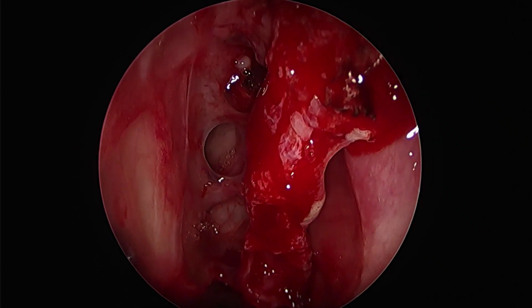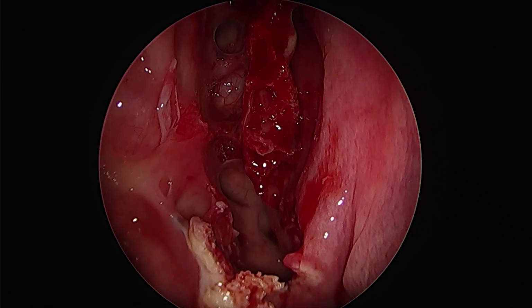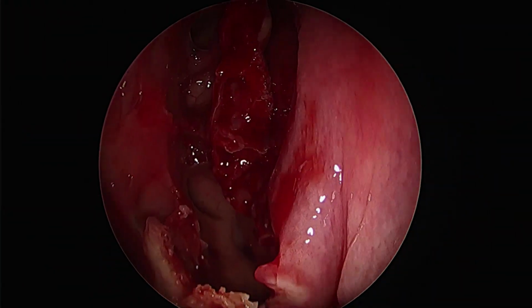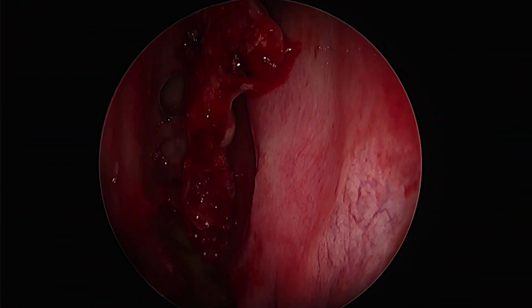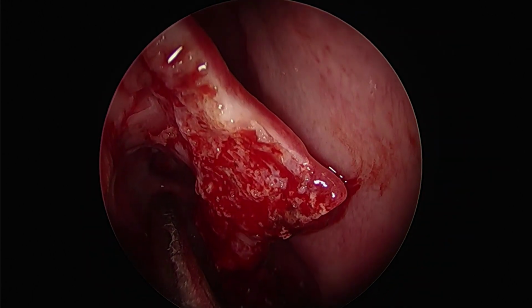A very small, tiny osteoma seems to be there in the region of the frontal recess. We can leave it behind without any trouble. The resected middle turbinate seems to be okay. No active bleeding, and this normally completes our procedure.